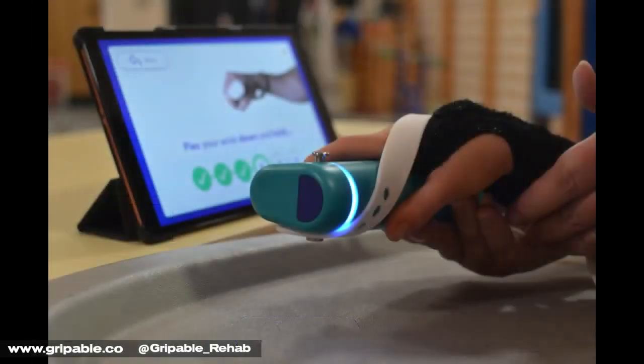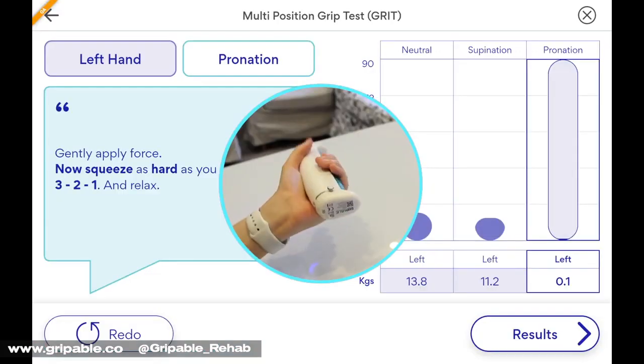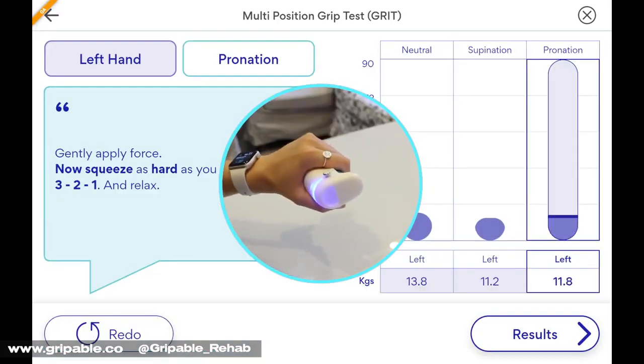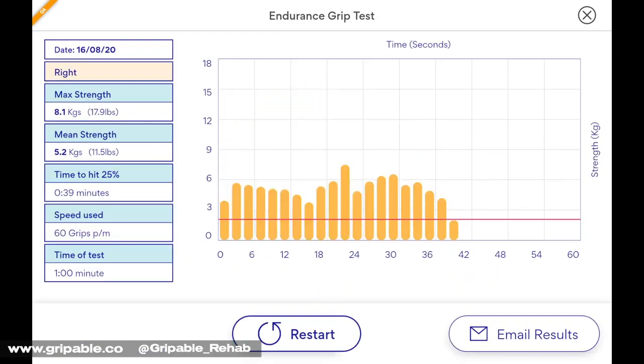Grippable is a highly portable instrument which complements standardised assessments with more functional measurements, including endurance and sustained grip tests, the multi-positional grip test and the rapid exchange test.